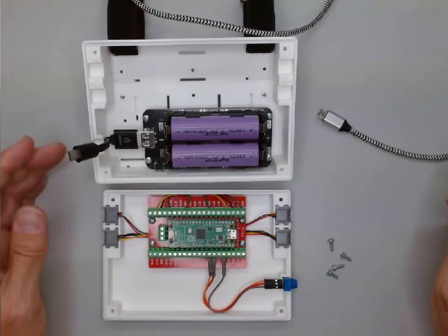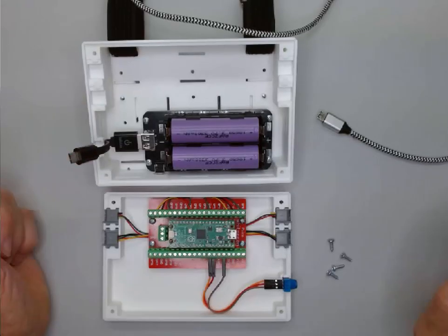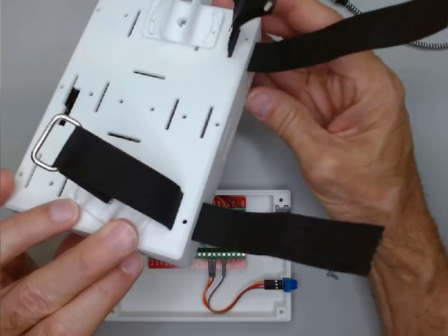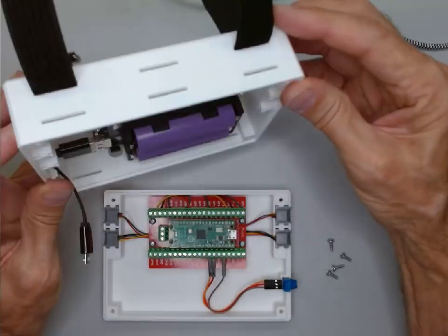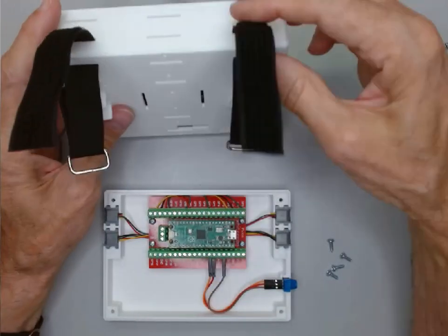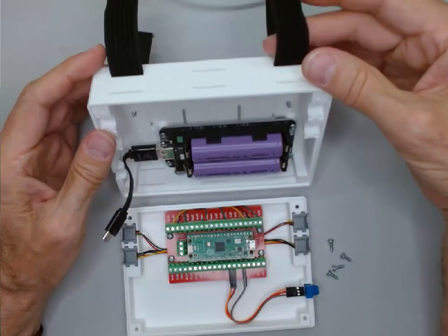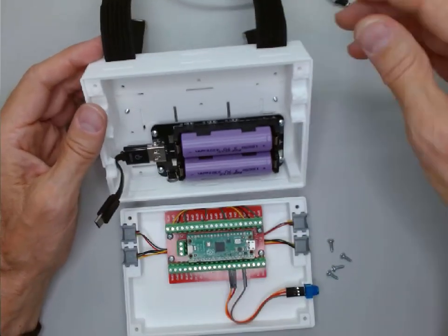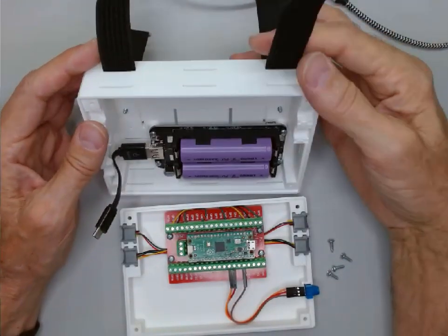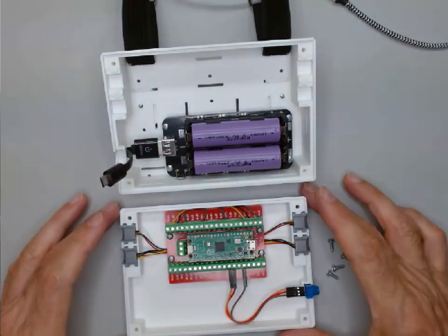Now I want to bring the two parts of the control unit enclosure together. But before I do, I want to point out that I did run some Velcro through the top part of the back. It's also going to mount to the walker. And of course, it's nigh impossible to do that once the enclosure is sealed. So, again, think about any Velcro you want to put on before you bring these two halves together.